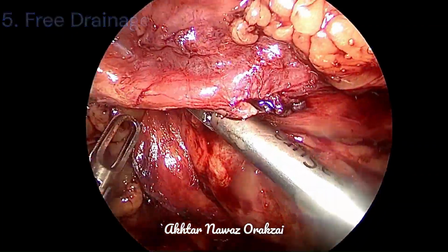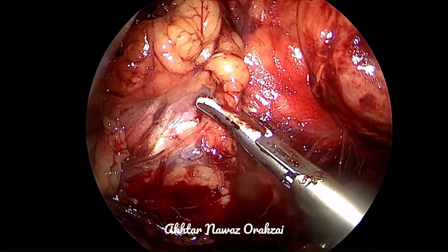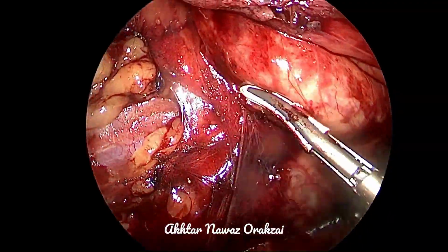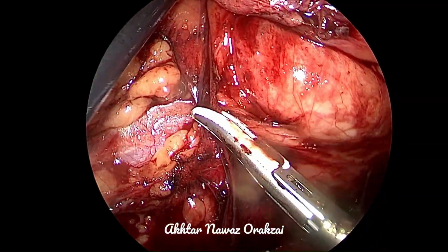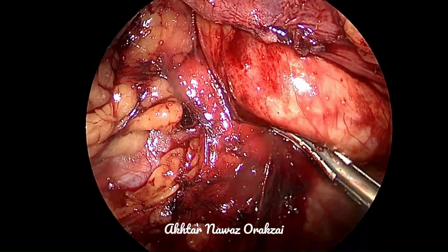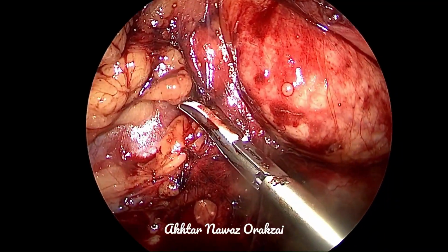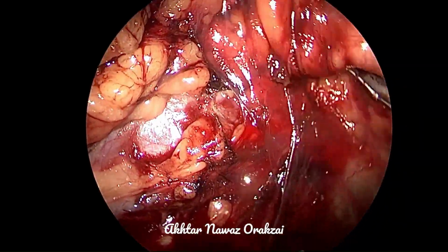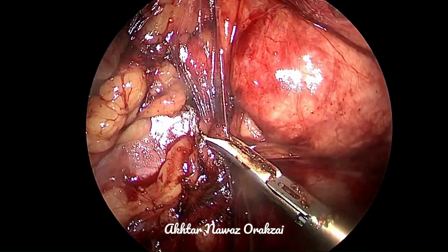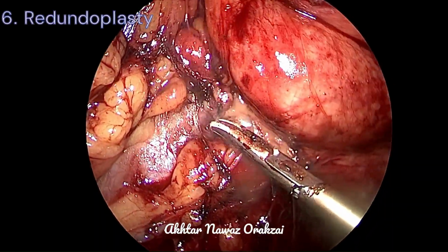The fifth principle is free drainage. Free drainage can be achieved through a DJ stent or a nephrostomy tube. However, the DJ stent is preferred because it is internal drainage, and the catheter needs to be placed as well. This free drainage is needed for a minimum of 72 hours, because the inflammation starts subsiding in 72 hours, and then the epithelium usually covers the area. So it gets sealed and the edema subsides, and thus free drainage will help.